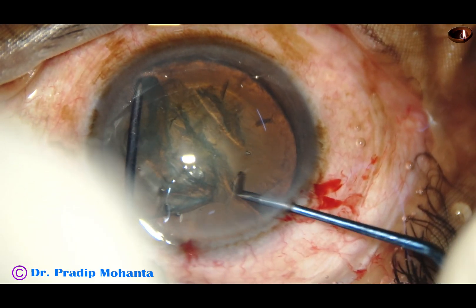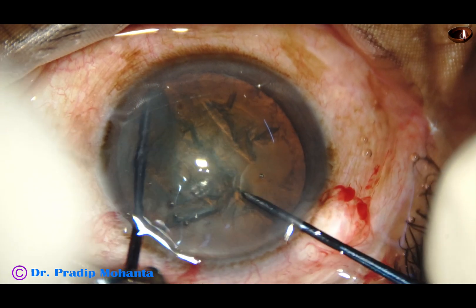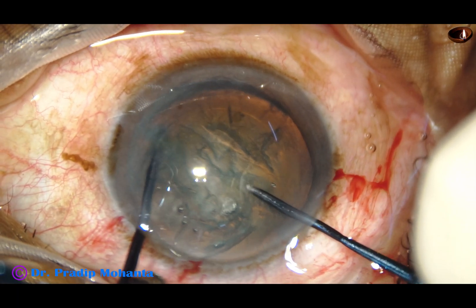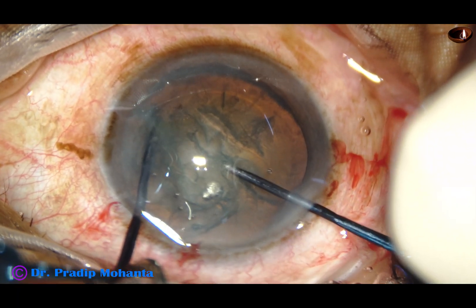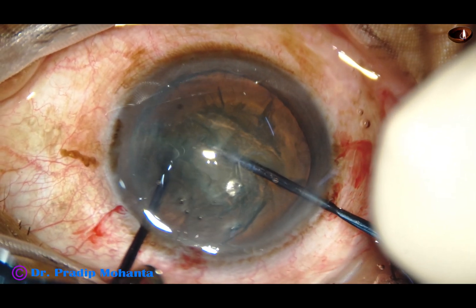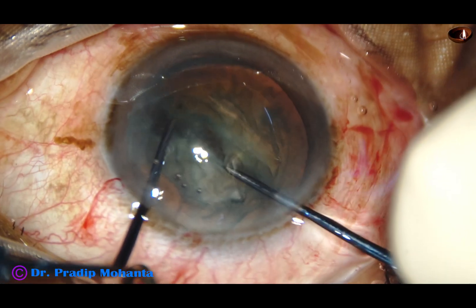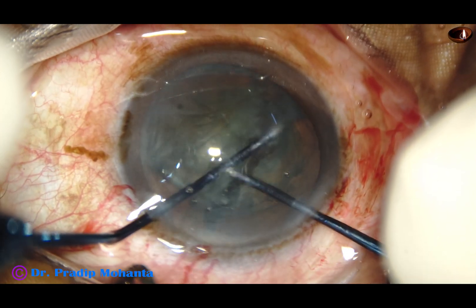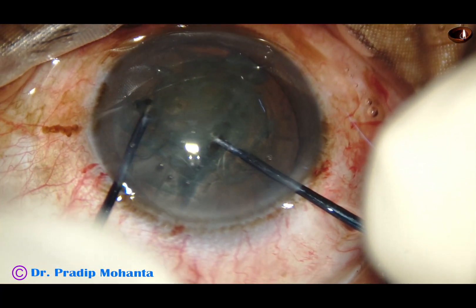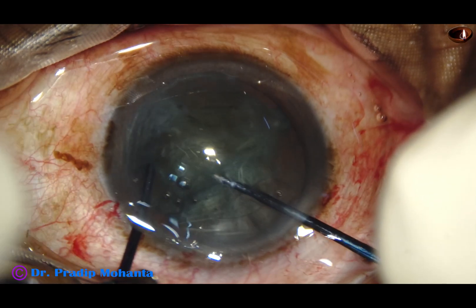Here goes the pre-chopper. Scratch the surface, come near the rhexis margin and embed it, stand vertically. Both instruments stand vertically and come to each other. The nuclear sustainer — don't keep it slant. Beginners keep it slant and don't get a nice crack. So, after hooking the equator, stand vertically and bring the two instruments together. Both instruments should stand vertically and come to each other.